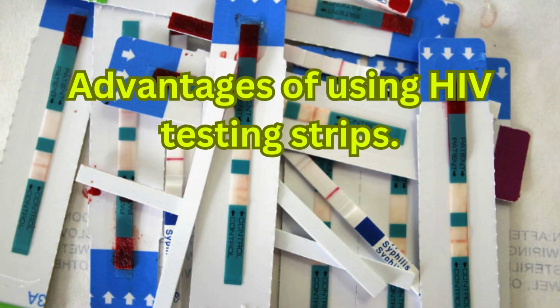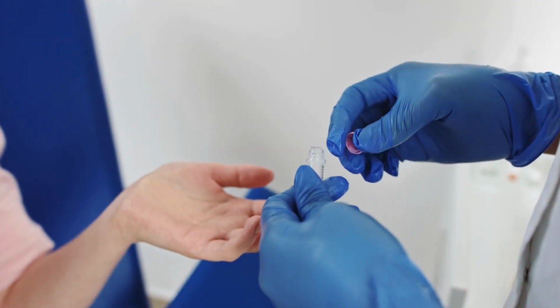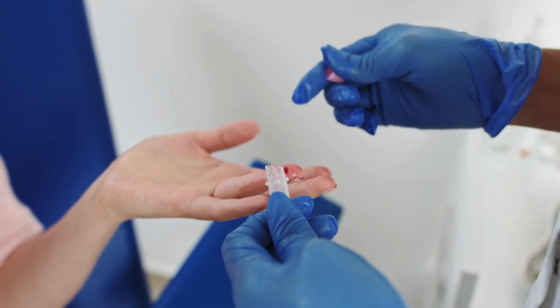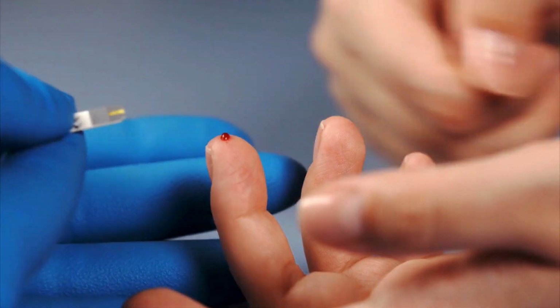Advantages of using HIV testing strips. Rapid results, 15-30 minutes. They are easy to use, requiring minimal training. They are suitable for point-of-care and home testing, and no specialized equipment is needed.